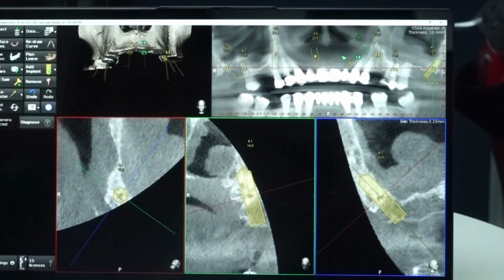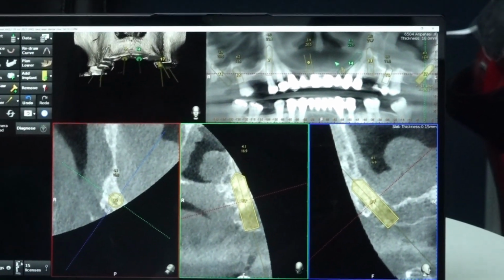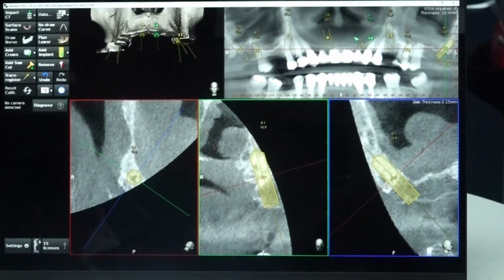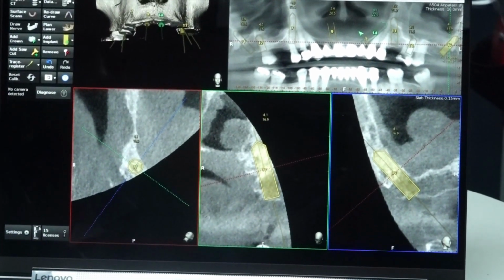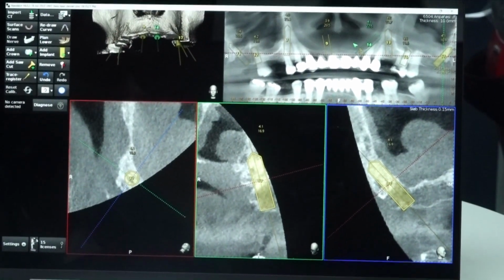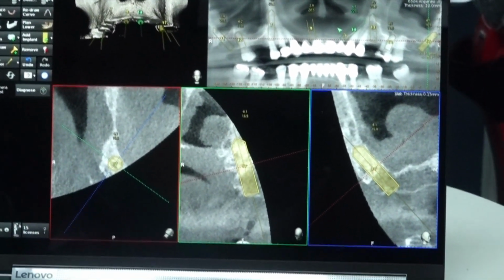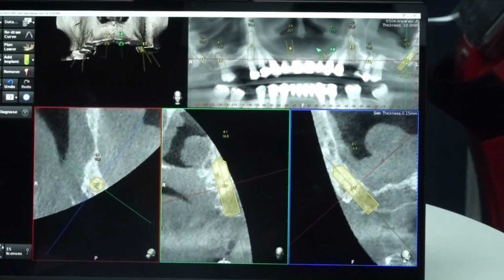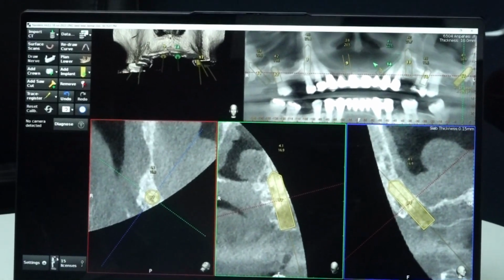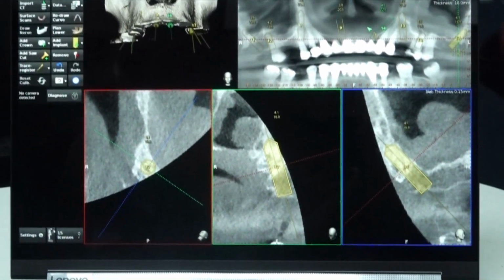If you do the same scenario with single piece, the challenge will be the pterygoid implant angulation. Pterygoid implant angulation will be less than ideal. It will be buccal and mesially tilted, right? Of course, you can bend. The bone quality in the pterygoid is good, but you cannot achieve good parallelism with all the implants. Whenever pterygoid is present, prosthesis insertion is quite challenging.